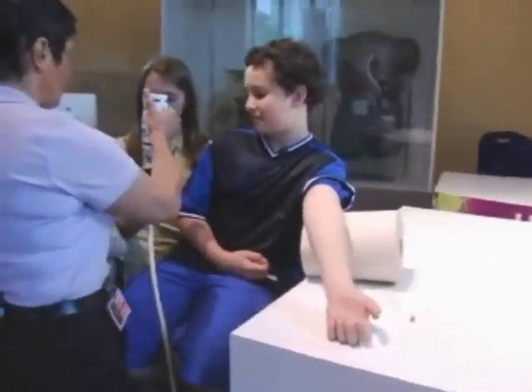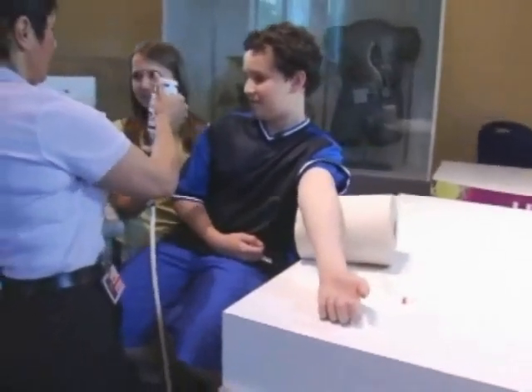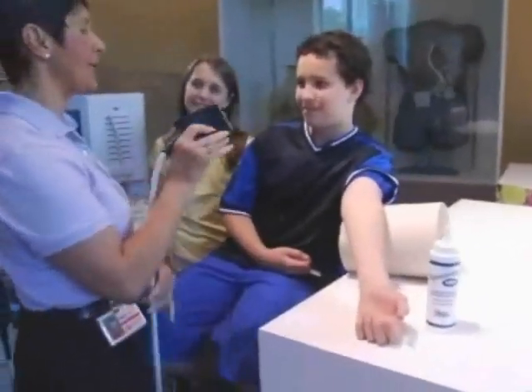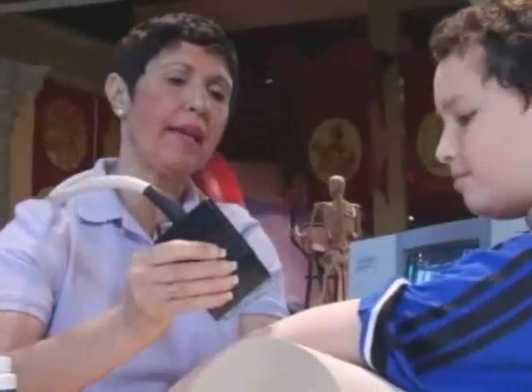I'm going to put this on top of the transducer. Thank you, Brittany. Isn't this fun to put this on Matt's arm? Do you think Matt has an artery? Do you think he has an elbow? Well, that's a guess, a prediction, a hypothesis. Let's see if we can support that. Let's take a look.